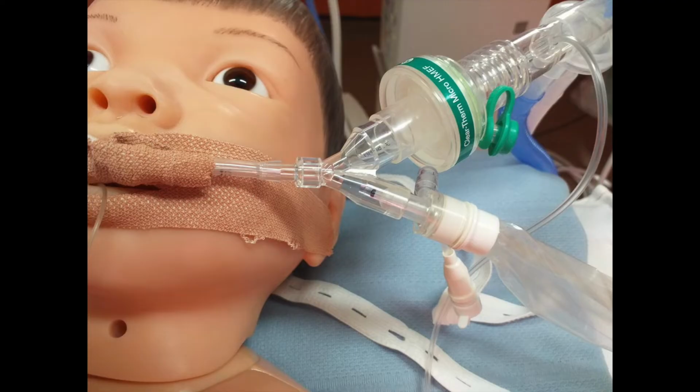For very small children, it may look like this. The small inline suction comes with a Y connector that attaches to the tube after cutting off the end of the tube, and the inline then attaches to one end of the Y connector and the HME filter and the end-tidal and circuit to the other end.